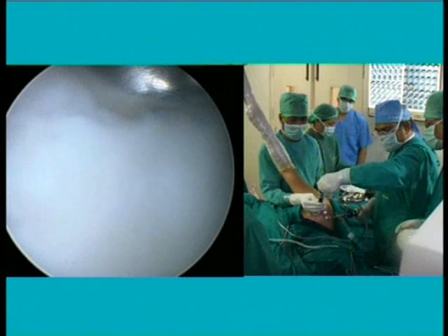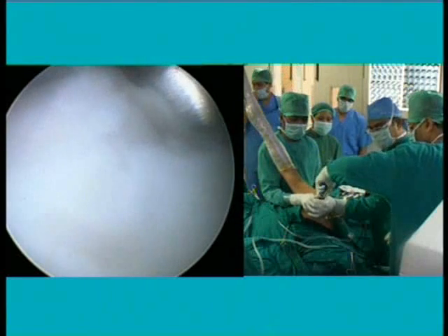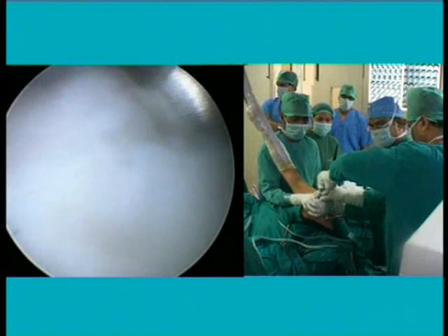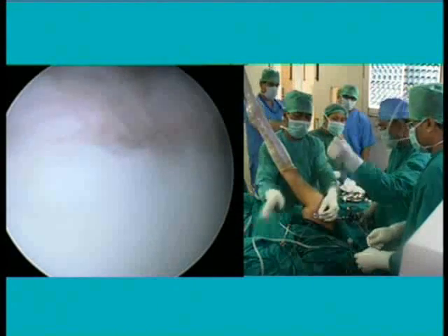Now you unscrew it. Then a small twisting and you pull it. You don't need to do reconstruction. That was only done about a month back at our Delhi arthroscopic course. See, easy. So I am going to present an edited video of the AC joint. It was very well done, so I decided to present this video.